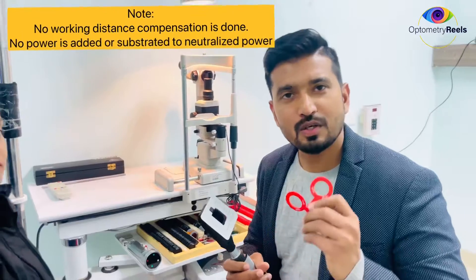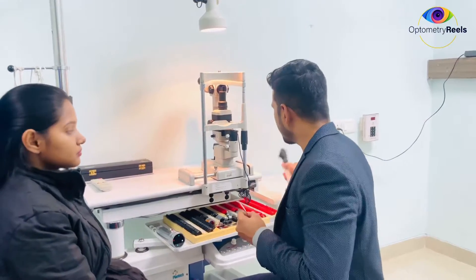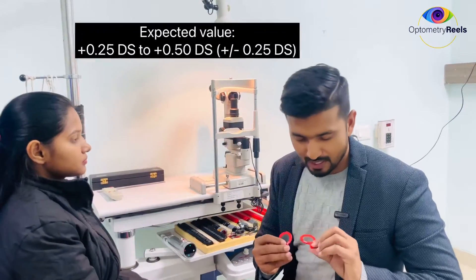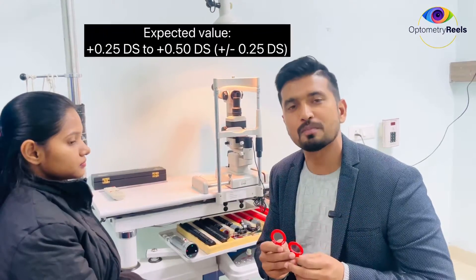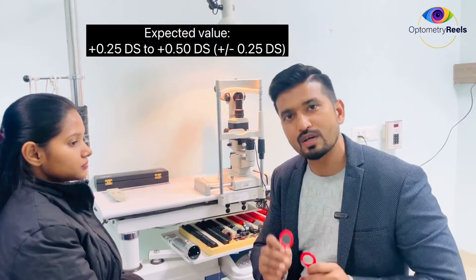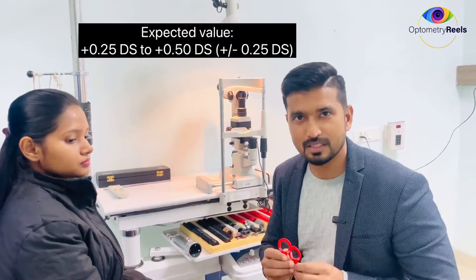I can neutralize that with plus 0.50. Make sure you are not keeping the lenses for a longer period of time in front of the eye, as it can alter the accommodative response. The expected range for MEM is plus 0.25 to plus 0.50 with a standard deviation of plus 0.25. Any values below plus 0.0 or above plus 0.75 are suspicious for accommodative anomalies.